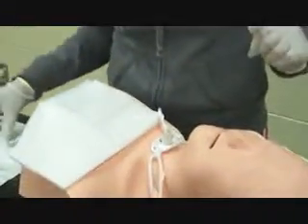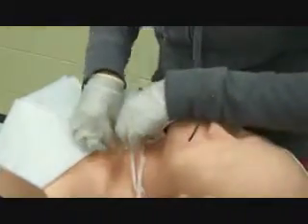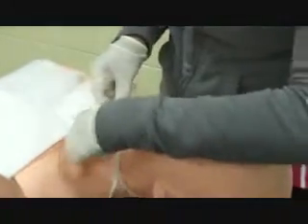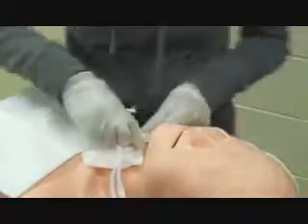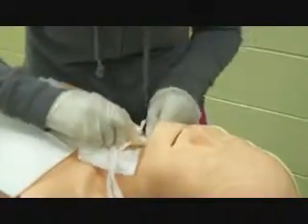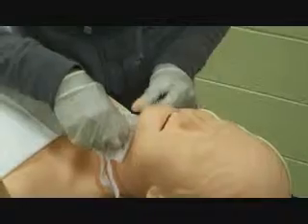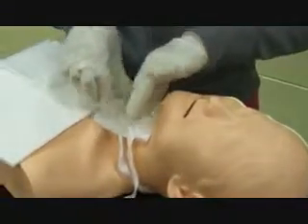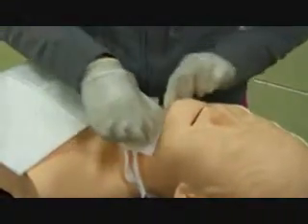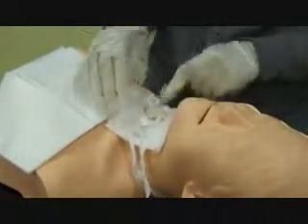And now we have replaced the tie, so now we need to replace our gauze with a clean gauze. So usually you would have tweezers to put the gauze under. And with as much care as possible, you replace the gauze and put it back under the patient's neck. And you want to make the gauze as flat as possible, so that none of the wrinkles will cause pressure on the skin and cause sores. And you would discard all the dirty materials.